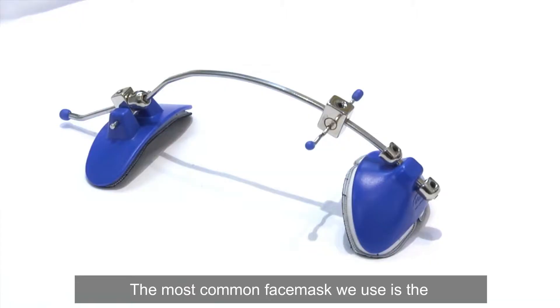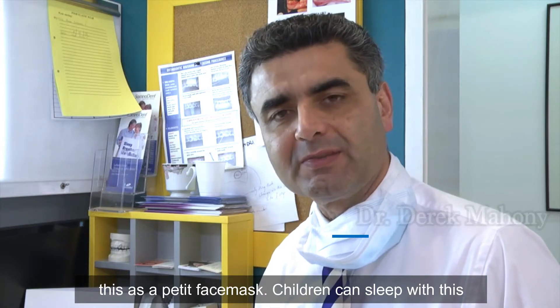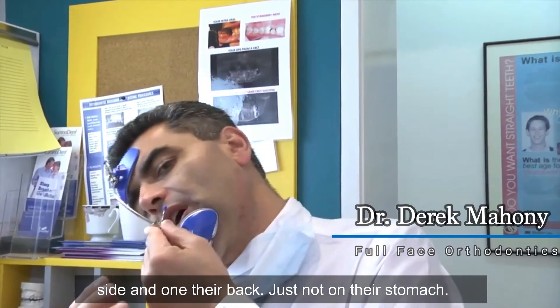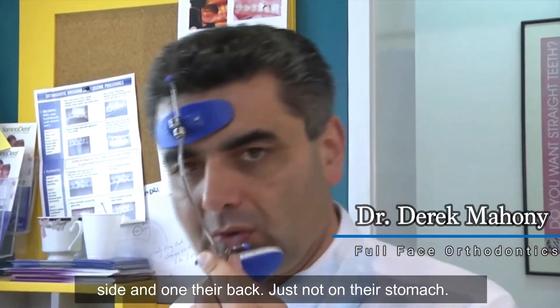The most common face mask we use is the dynamic protraction face mask. Some people know this as a petite face mask. Children can sleep with this on their side and on their back, just not on their stomach.